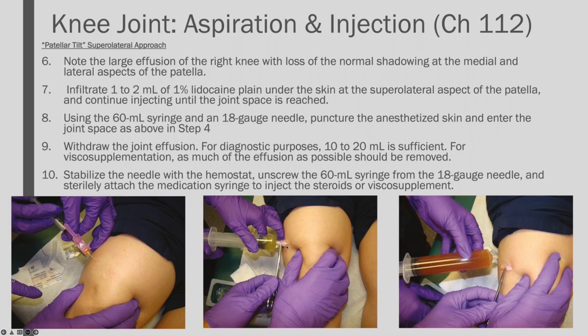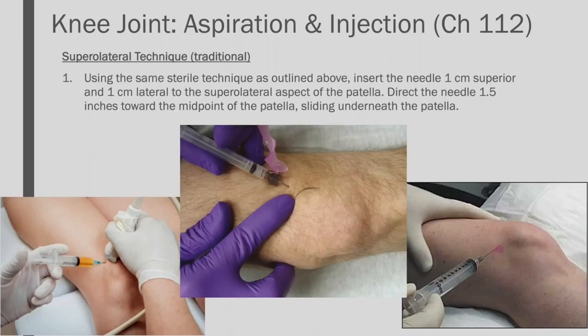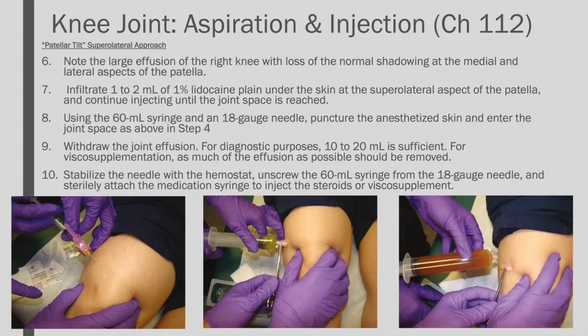See, it looks like it's a little higher than it should be for the knee, but remember that the knee bursa go up above even the joint. So a lot of times what providers will do as they're trying to get in there is they'll pull a little bit of traction on the syringe as they're going in, so that when they get in that joint, you see kind of a flash of fluid that fills up the syringe.